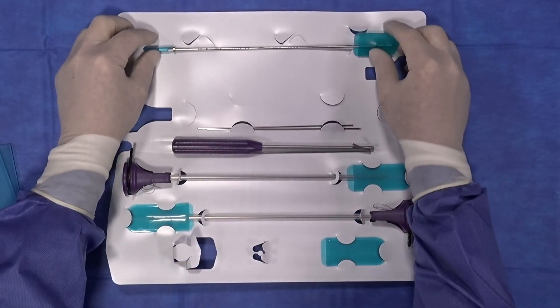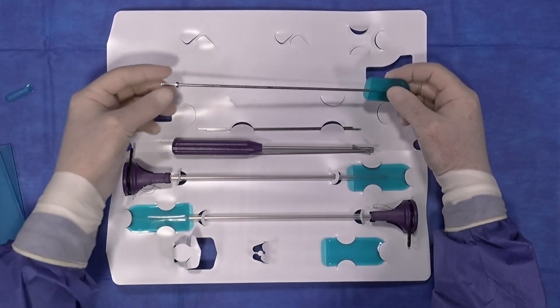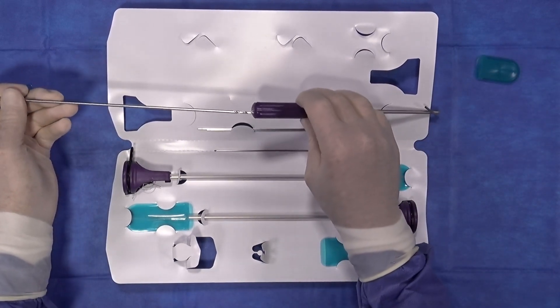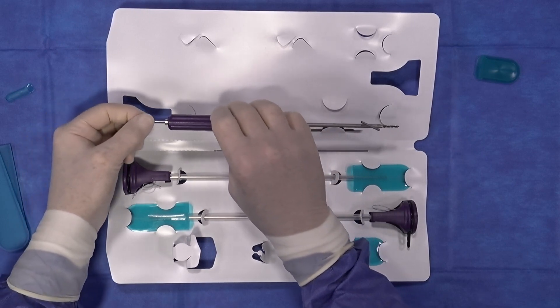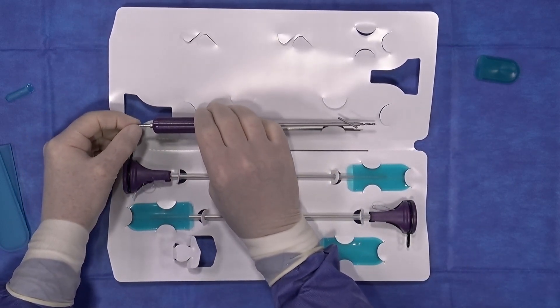The kit also comes with the necessary drill for the 3.0 knotless suture tack. This drill fits through the guide and has a positive stop so that you are drilling to the appropriate depth every time.